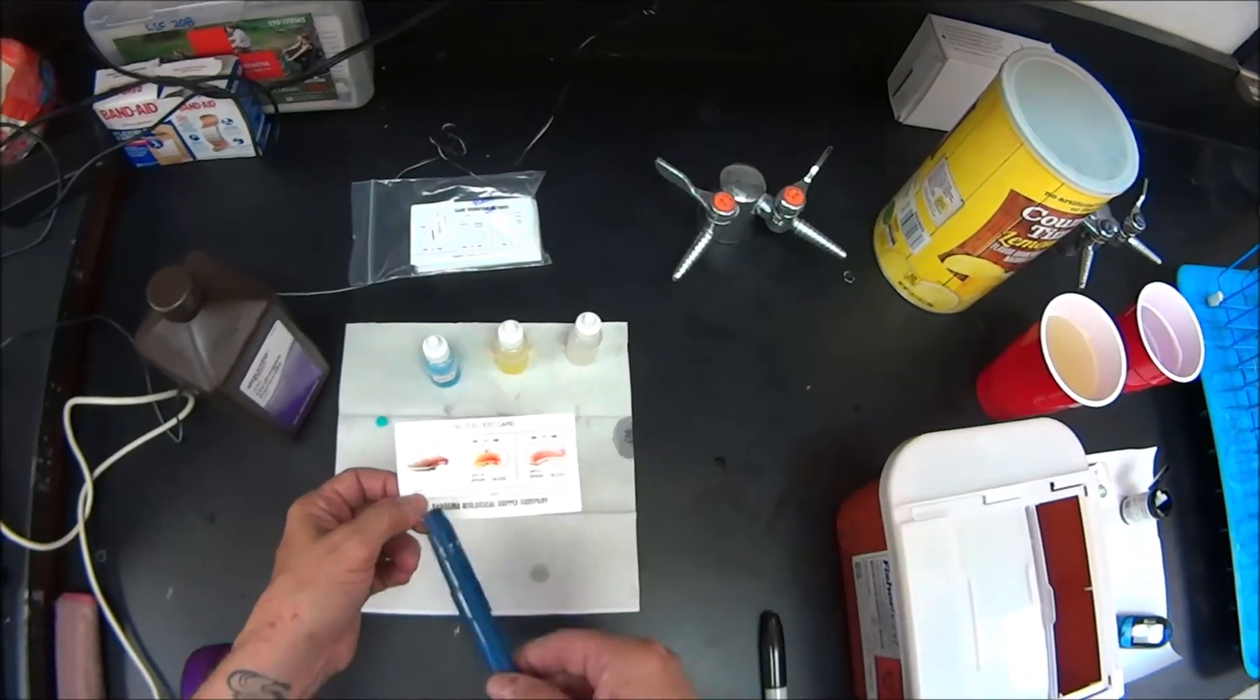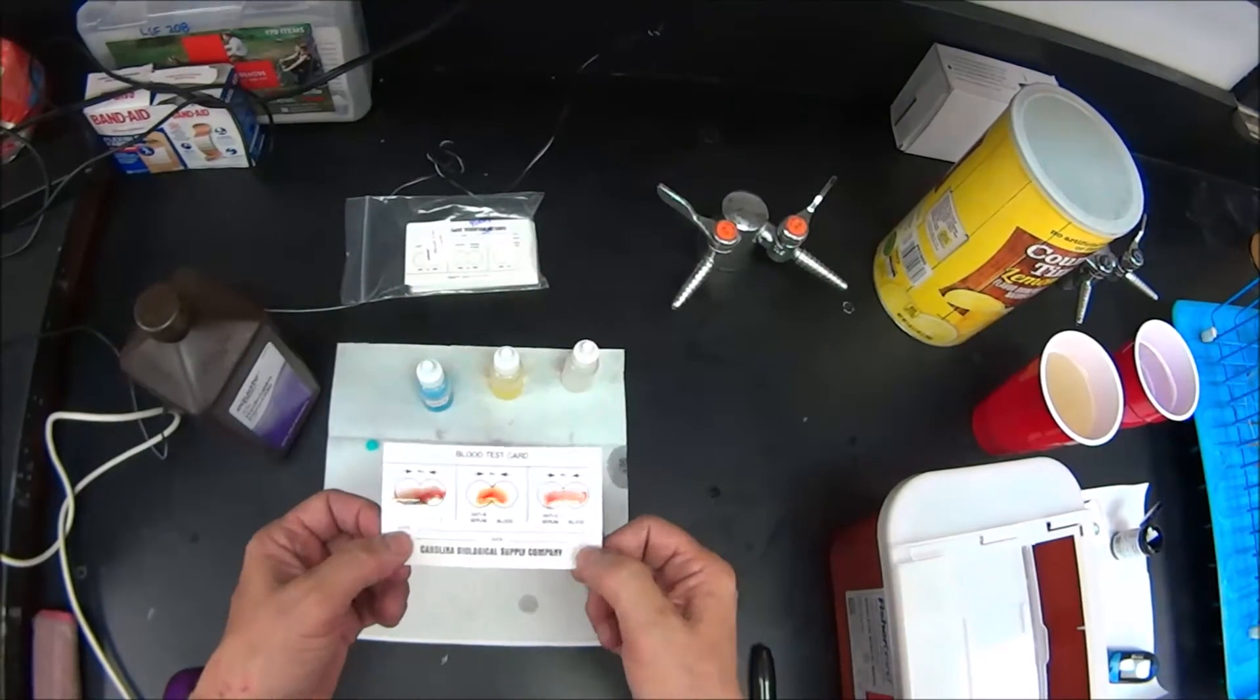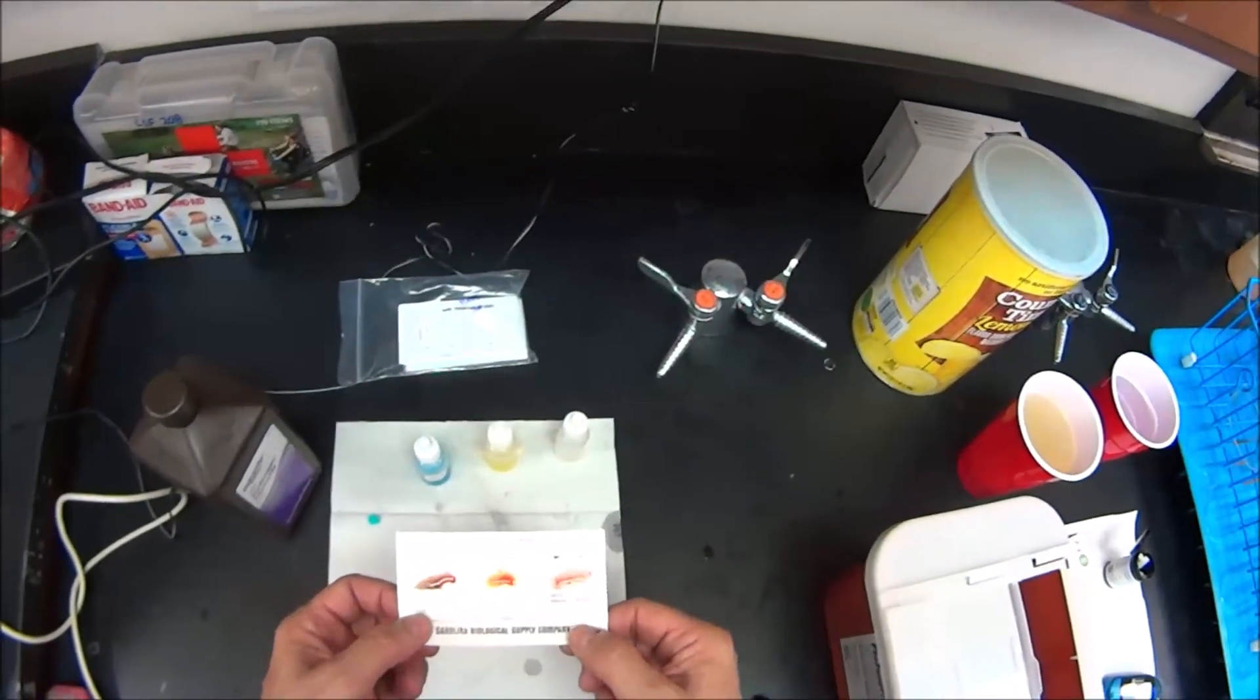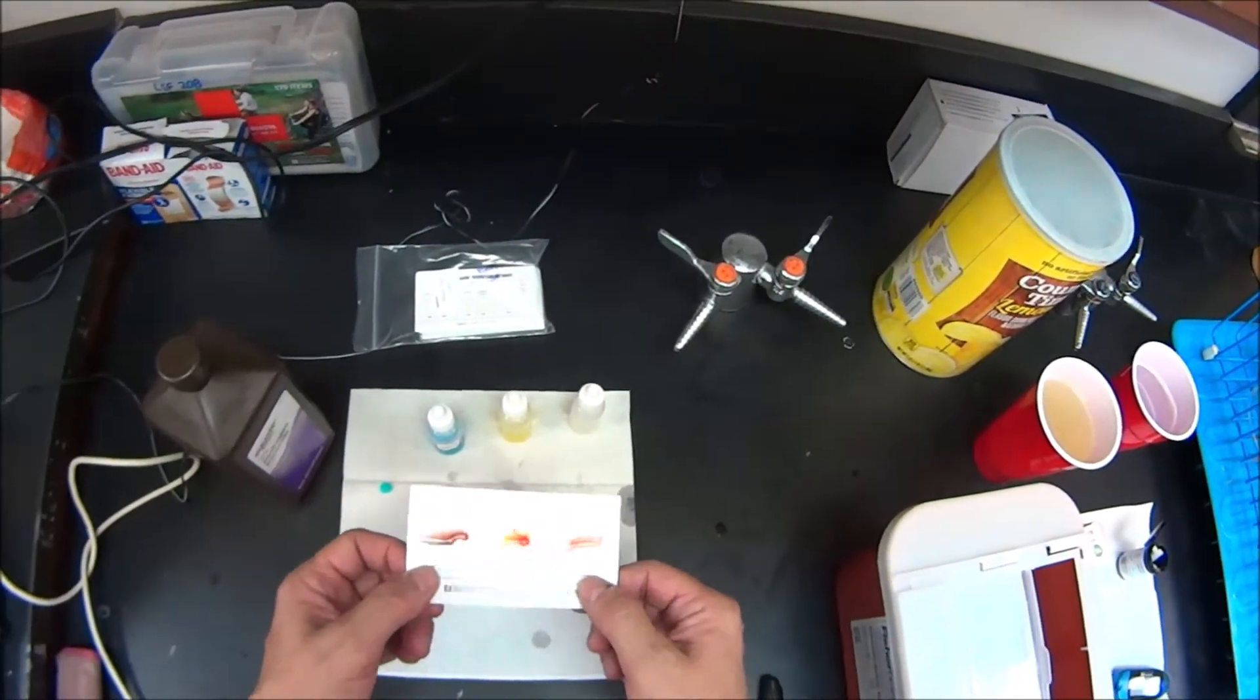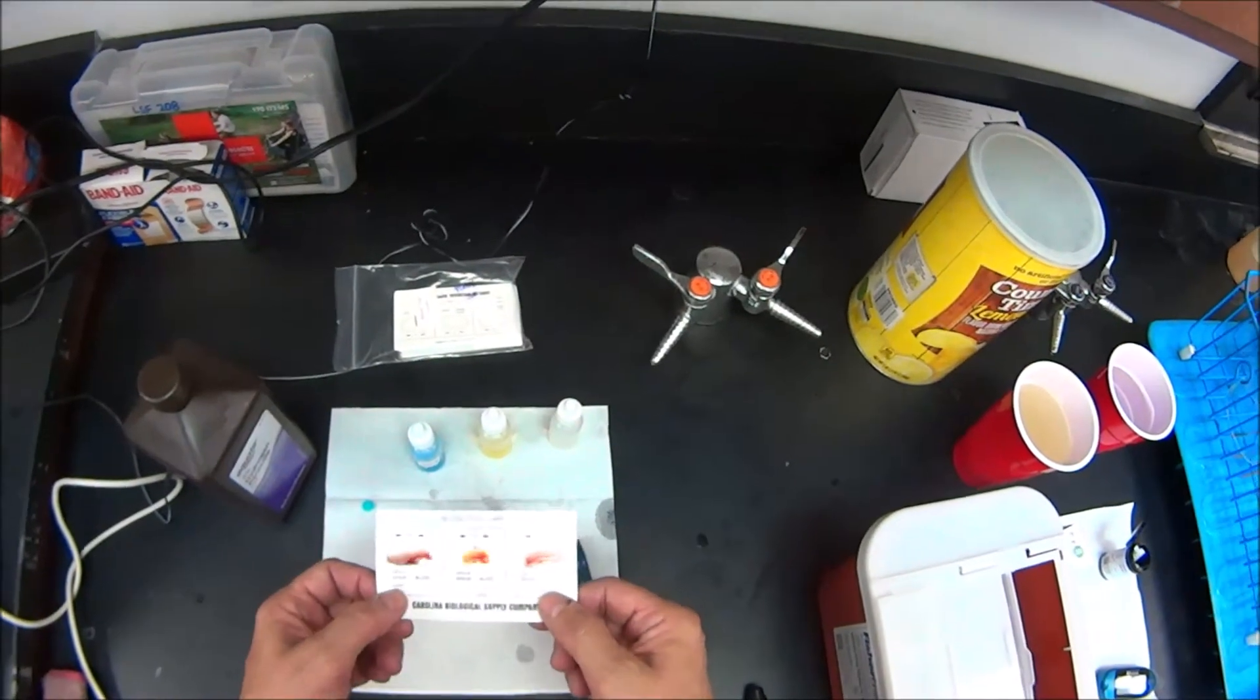Okay. Now in this well and in this well, the A and the B, I do not see any agglutination. So what that means is there was nothing for the A antibodies or the B antibodies to react with. That means I lack A antigens and I lack B antigens.